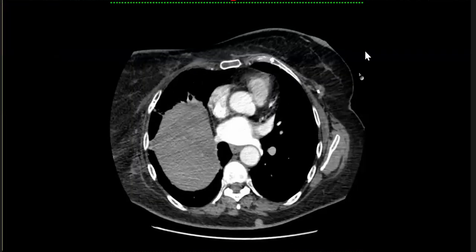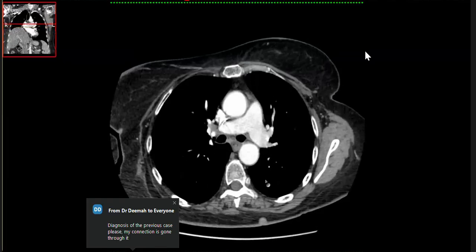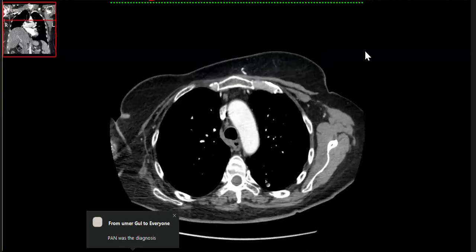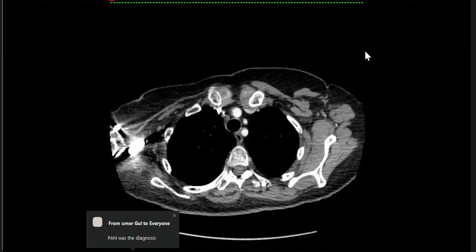No, no, I am asking you, why will there be the paralysis you have pointed out? Because there might have been any metastatic deposit along the course of that right laryngeal nerve. Which nerve? Right phrenic nerve. So, okay.